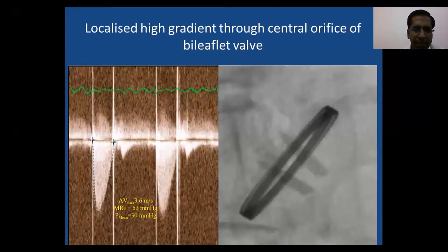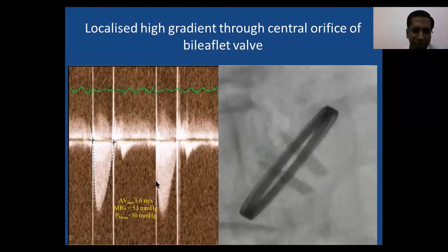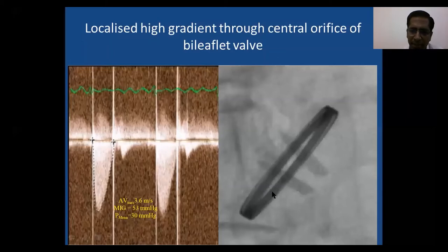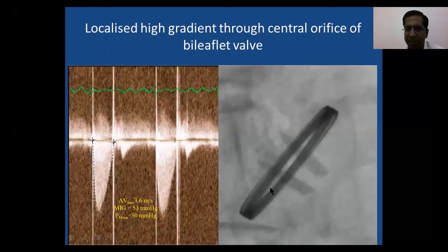Bileaflet mechanical valves can show high gradients through the central orifice even when the valve is functioning normally. The contour is triangular, valve clicks are present, and fluoroscopy confirms full leaflet opening. This is because the central orifice of a bileaflet valve is inherently smaller than the lateral orifices. In practice it is difficult to sample the lateral orifice specifically, especially in the aortic position.